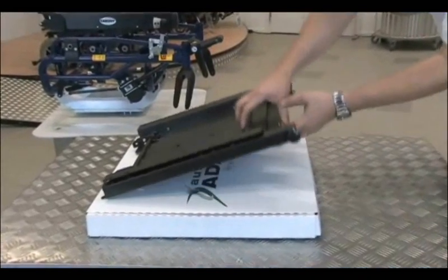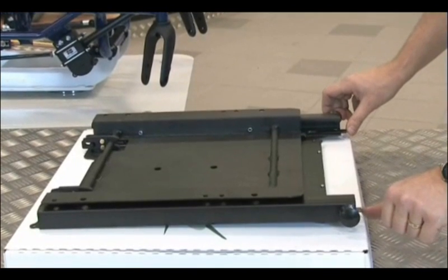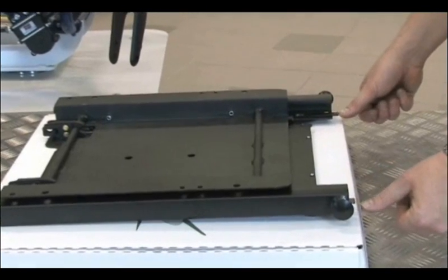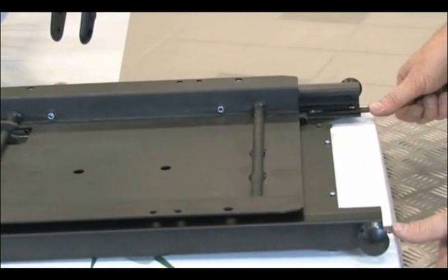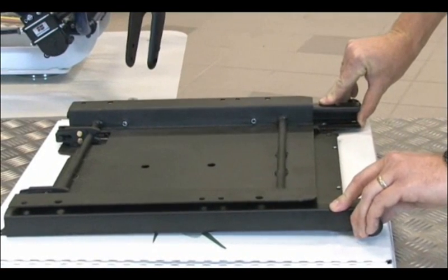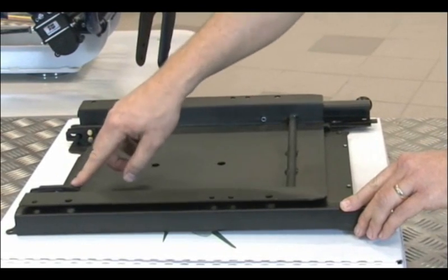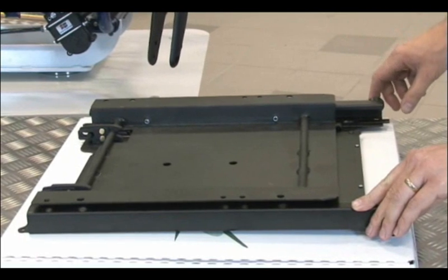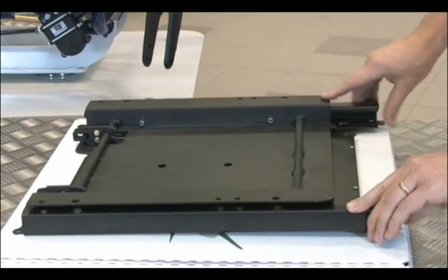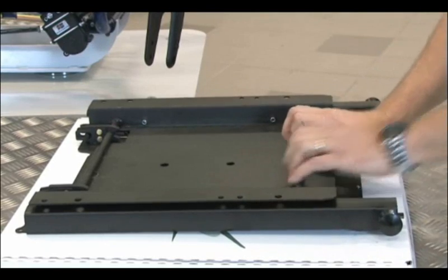To get these two pieces apart, you have to use your thumbs to push on the two metal bars that come out from the Carony rails. By pushing them, you release the locking piece from the rear two claws that clamp on to the rear axle of the Carony carriage. So as long as you don't release that locking device, you cannot release it.